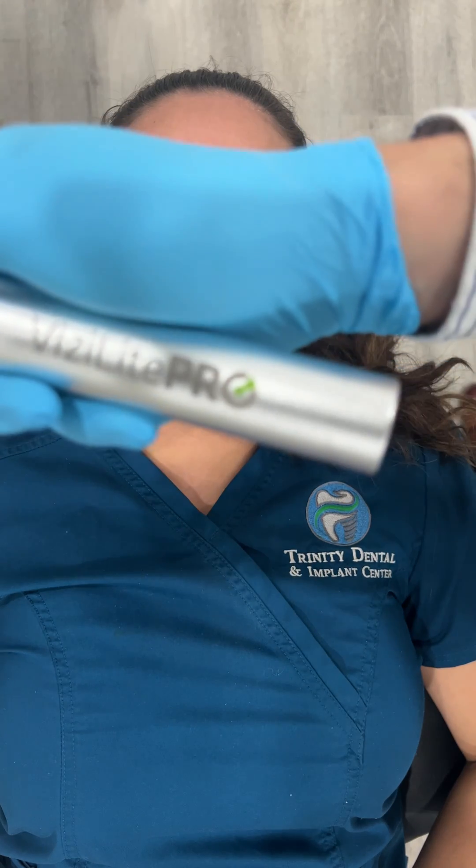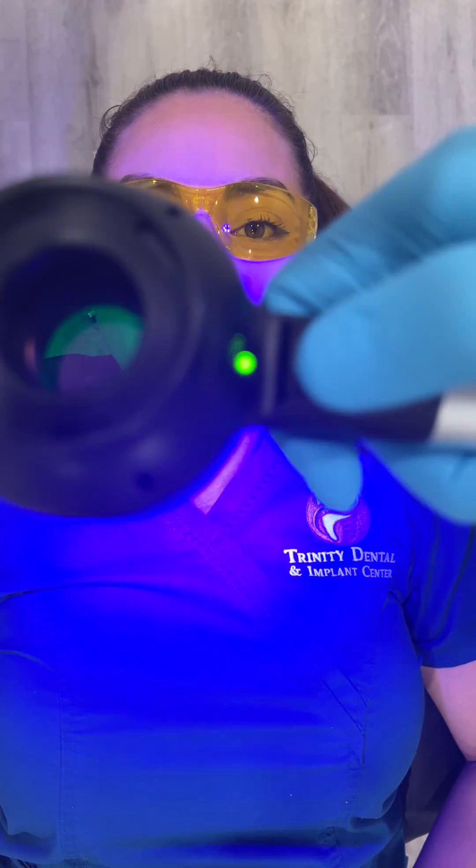Now we're ready to start our clinical examination. We're going to give the patient her protective eyewear first. And we're going to take the Vizilife Pro, turn it on, put it in position, and look through it.